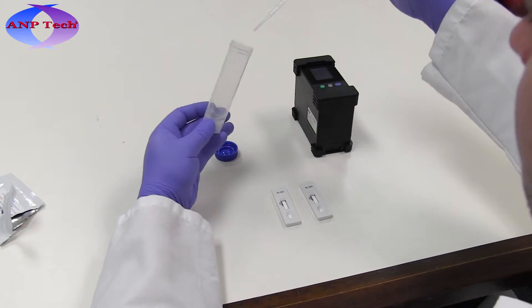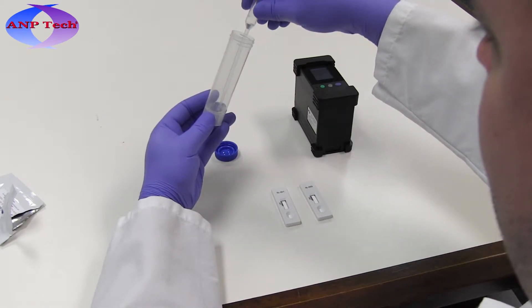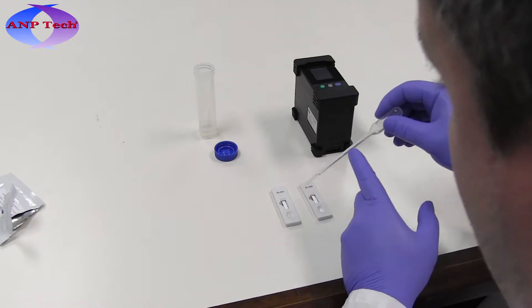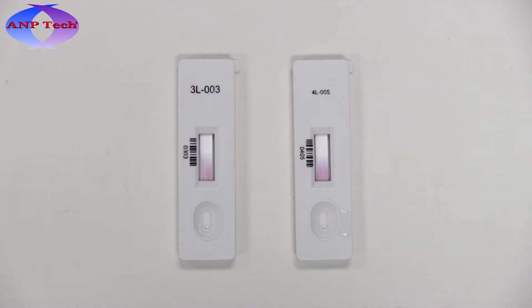After sample collection, simply add 3 to 5 drops, or approximately 100 microliters, of sample liquid to each sample well of the test to start an assay. A liquid front will cross the results viewing window as the assay runs.